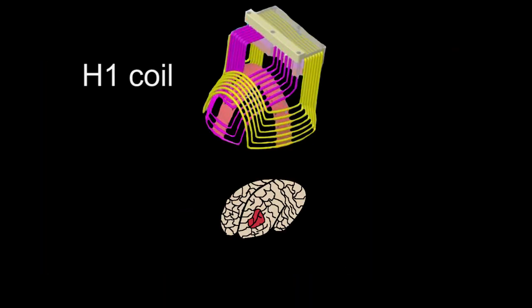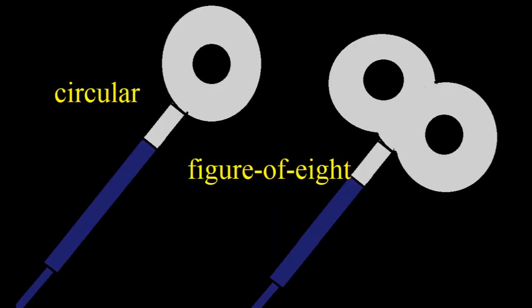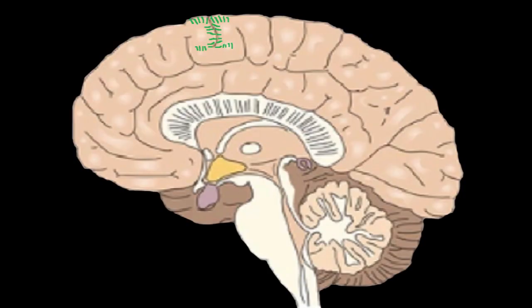During deep TMS treatments, an H1 coil targets neurons in the prefrontal cortex. This area is critical to reward-based decision-making. The H1 coil electrical fields have a larger target area, deeper penetration, and slower rate of decay than those of circular or figure of 8 coils. So, more neurons are under the influence of the electric field. Evidence suggests that the neurons deeper in the brain folds are positioned parallel to the electric field and are more receptive to the stimulation.